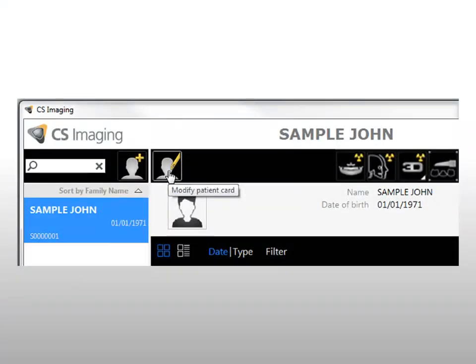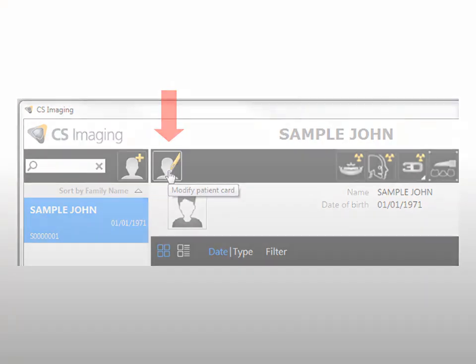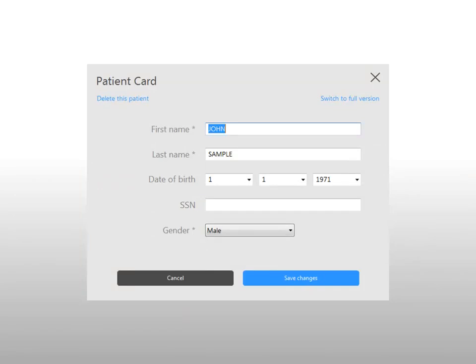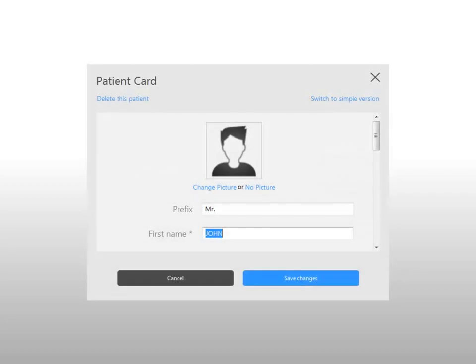To modify a patient card, in the Patient Browser toolbar, click Modify Patient Card. The patient card window is displayed. Modify patient information in the Patient Card window as required. If you need to enter additional patient information, click Switch to Full Version. When you have finished entering data, click Save Changes.